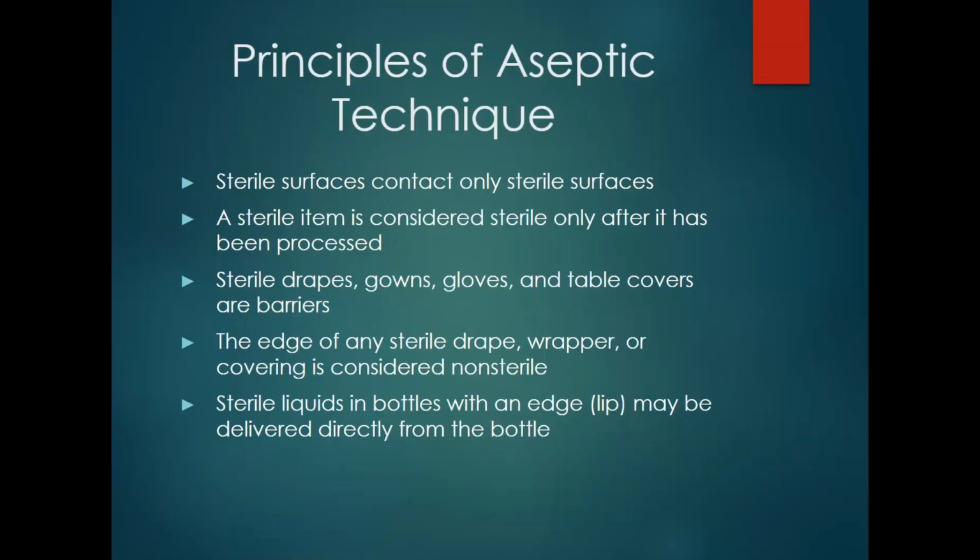You cannot pour half of the liquid because you have a small basin and then recap the bottle and pour the rest later. Once that bottle is recapped or once it's brought back up, it's no longer considered sterile. So if I had a small basin and I was only able to use half of the irrigation, then the other half is just a waste. It's no good anymore.